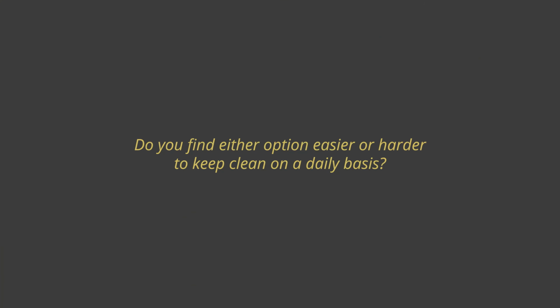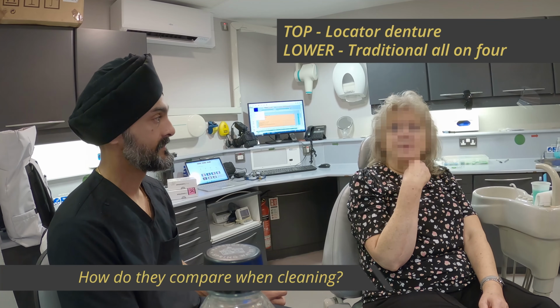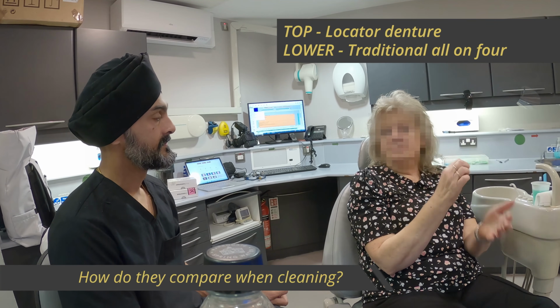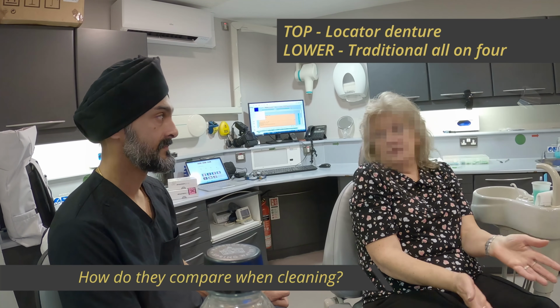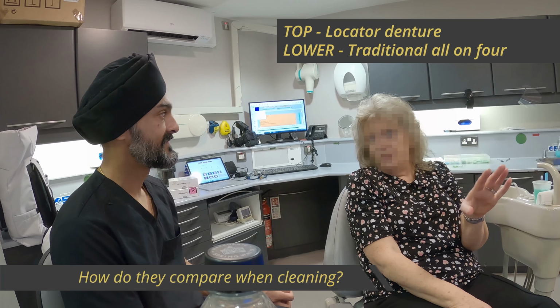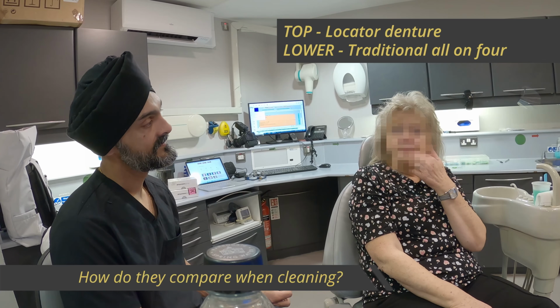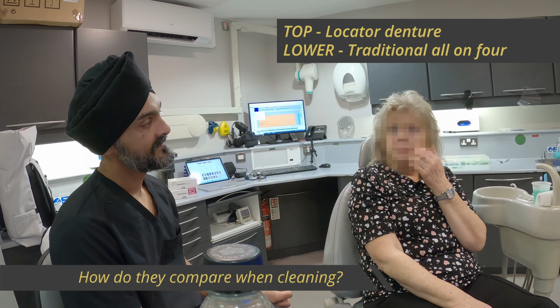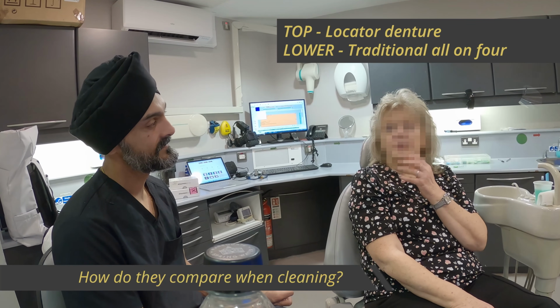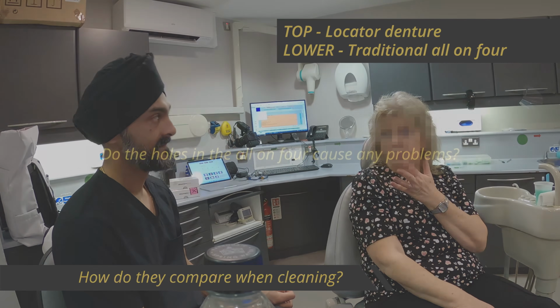So the top is far easier because you can get around the implants. You can clean the teeth because you can take it out and you can see it can be spotless. You don't have to have any food on that at all. There's no guesswork, is there? No. You see, at the bottom, you have to be careful that you try and make sure there's no food left there because obviously that is going to damage the implants.